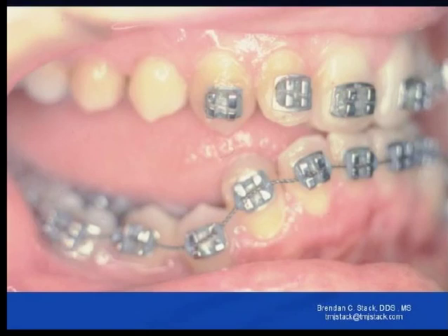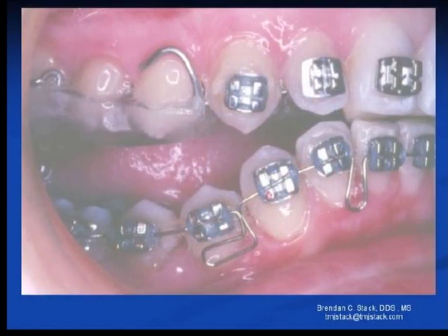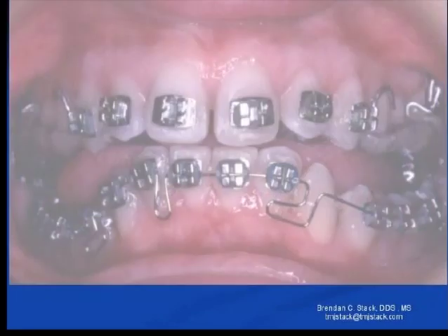The initial arch wire is a lower Twistaflex wire that is very flexible and goes through all the teeth. Nowadays we would use a titanium or a nickel titanium arch wire to do this. The second wire is an 016 multi-loop stainless steel wire, the multi-loops providing flexibility of the arch wire and making it more gentle. Make sure the horizontal portion of the boot loops are extending towards the depressed teeth. This gives you maximum mechanical advantage. This is the same wire from the front.